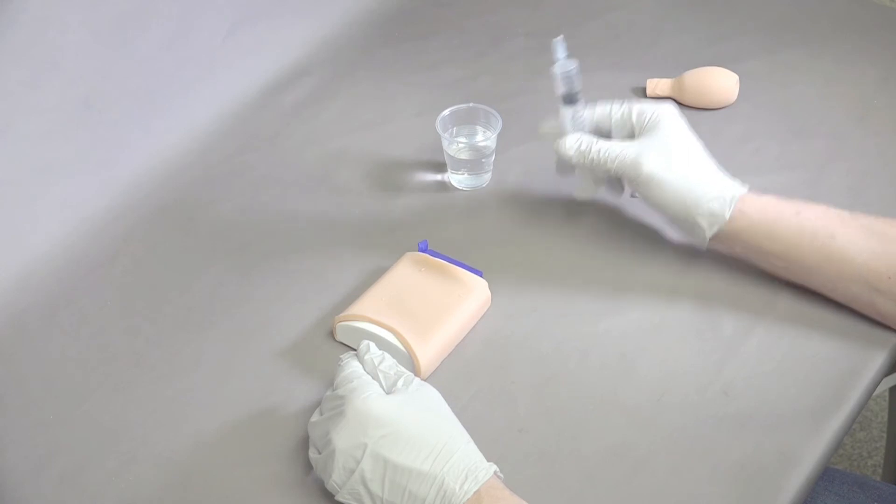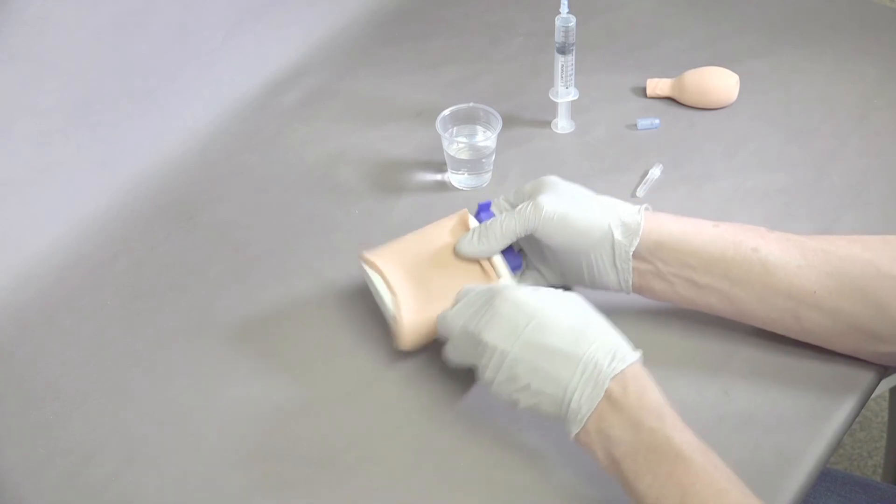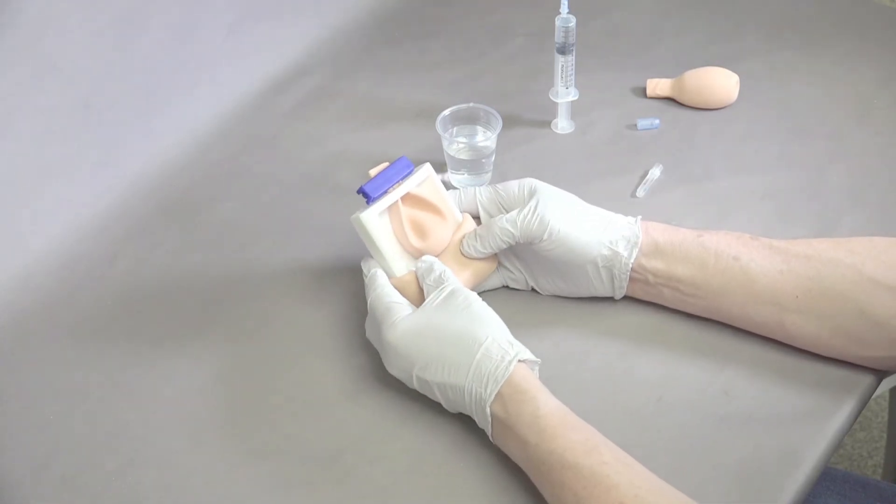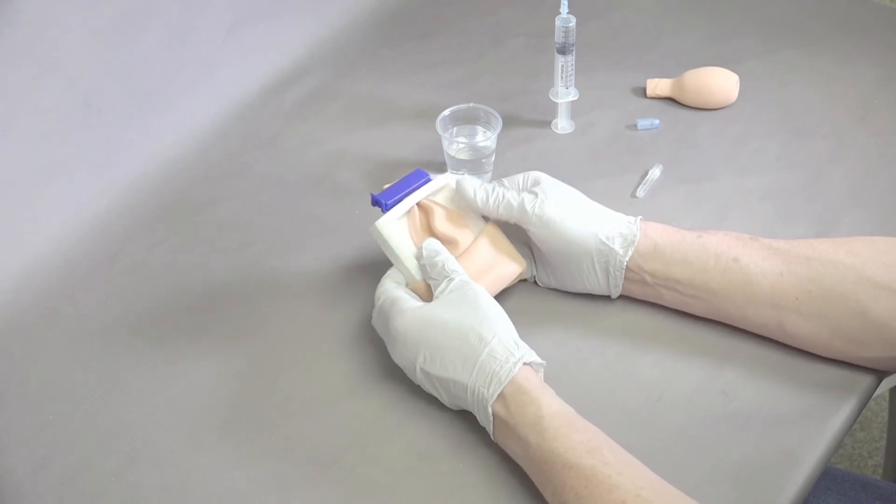You can see that I've removed now probably about 8 ml of fluid. If we pull this out and have a look, you can appreciate that the bladder doesn't have much in it, but still if we put pressure on it there's no leakage.